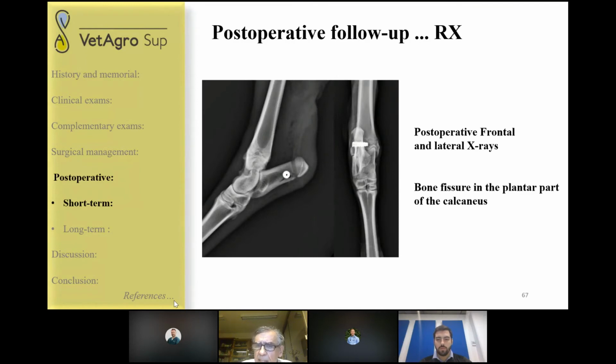And really, I think it will be fine maybe to drill a bigger hole. I did a 3.6 millimeter, and maybe it will be fine to do a 4 millimeter in a wild animal like a goat. I also did surgery on deer a long time ago, and really it's very, very hard, maybe harder than a dog.